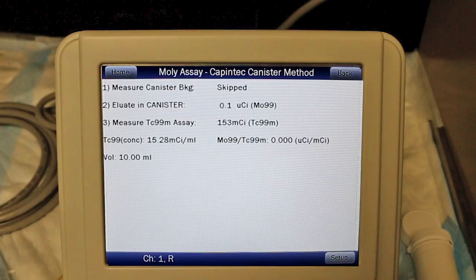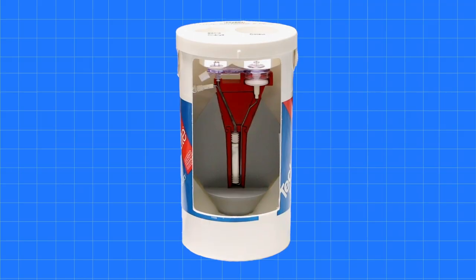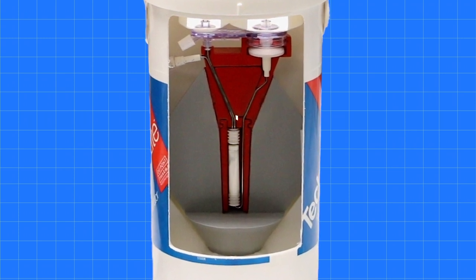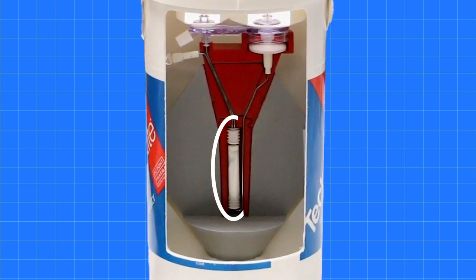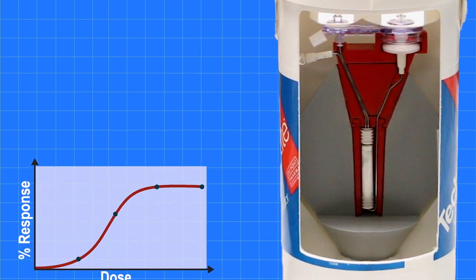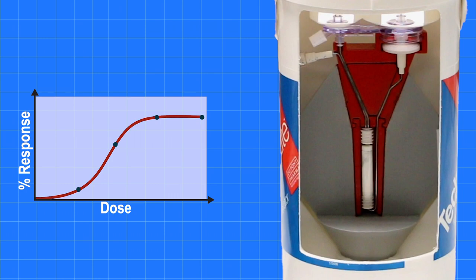If the reading exceeds the limit prescribed by the NRC, then the eluate is contaminated. Molybdenum-99 contamination is usually caused by migration of the molybdenum-99 in the alumina column with successive elutions. The amount of molybdenum-99 which is eluted with the technetium-99M should be as small as possible because the contamination by the longer-lived radionuclide increases the radiation dose without providing any benefit to the patient.